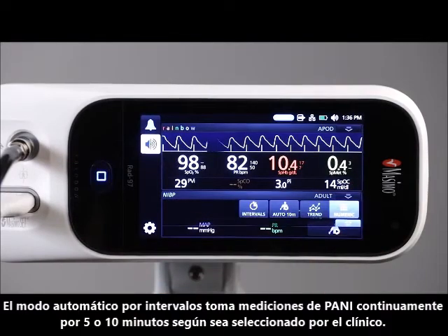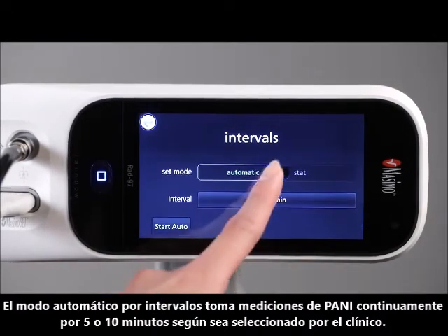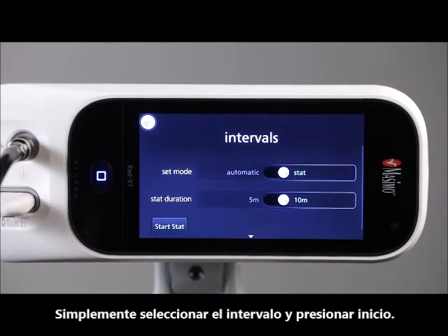STAT Interval mode takes NIBP measurements continuously for either 5 or 10 minutes, as selected by the clinician. Simply select the time interval and press Start.